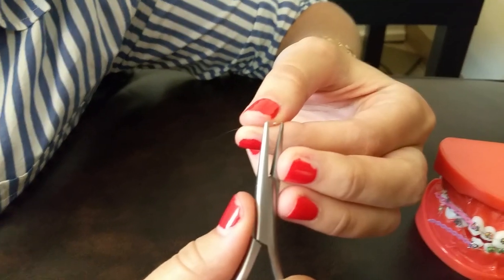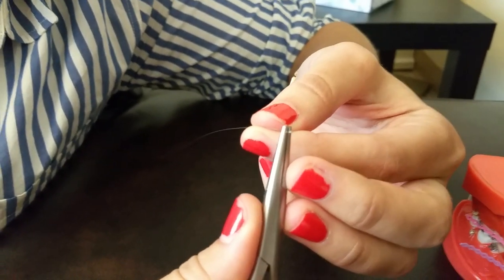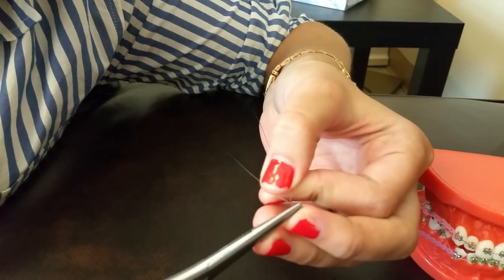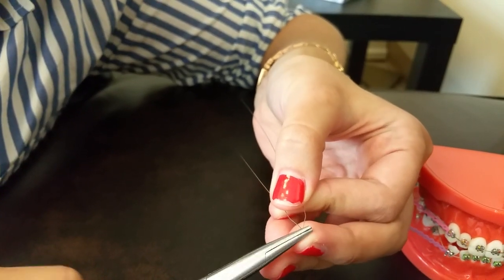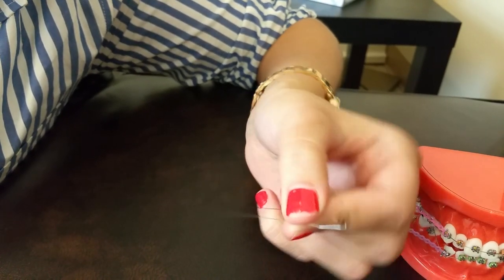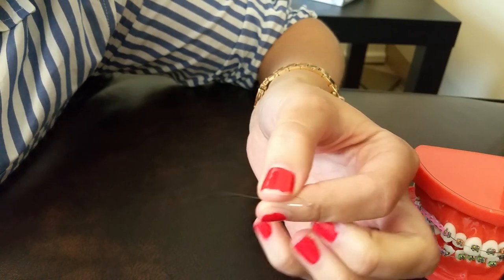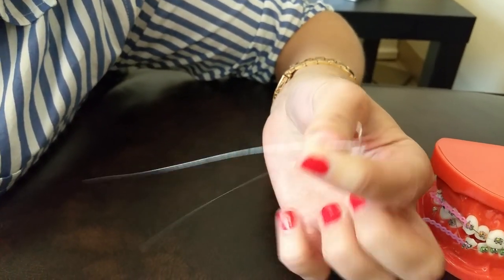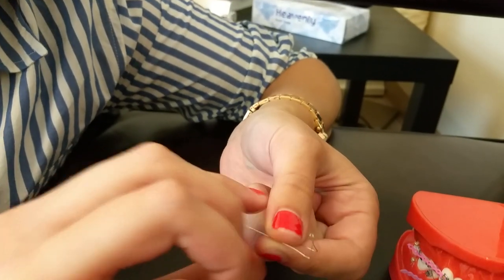To place ligature ties, you want to squeeze the tip, grab it at the end, and make a bend slowly up to where it's curved a little bit so it snugs the bracket. Then you want to make a 90-degree bend just like that.